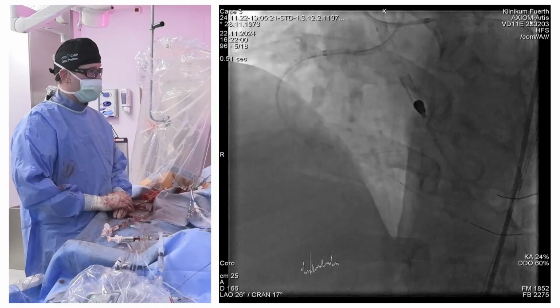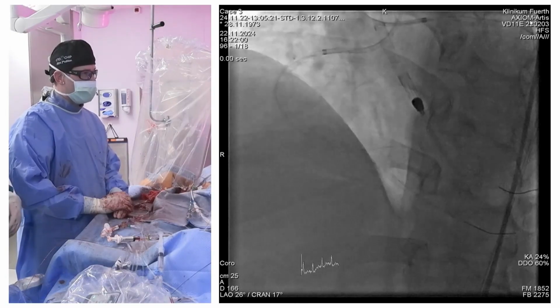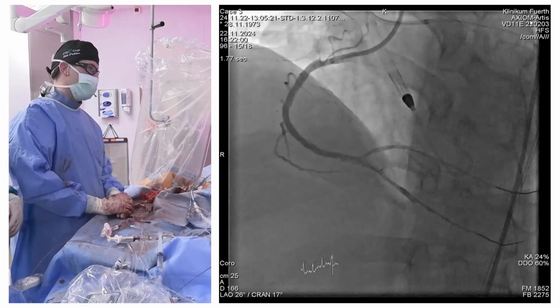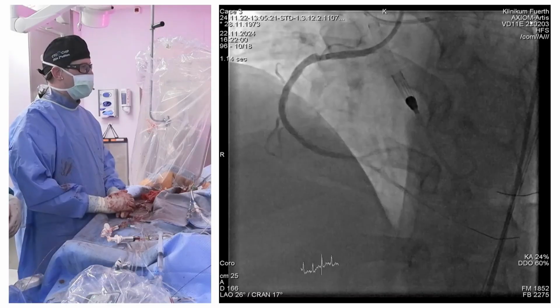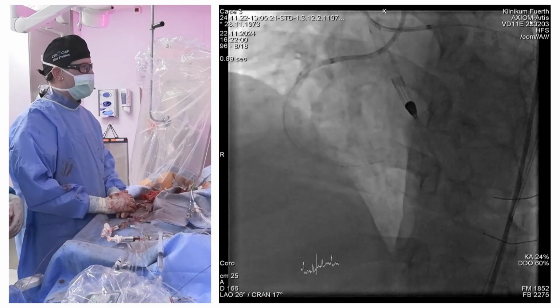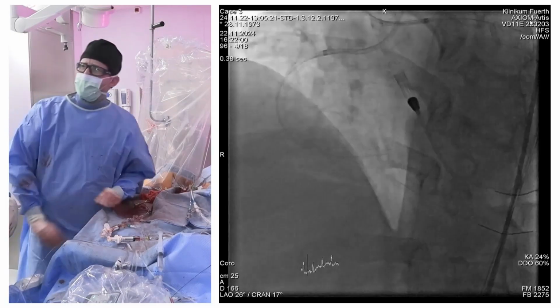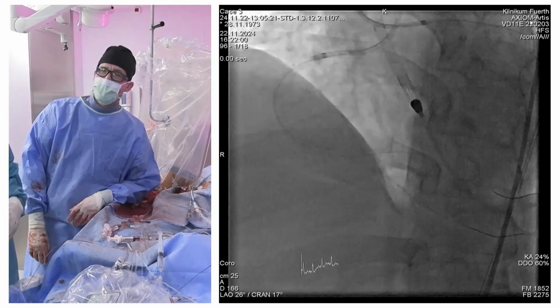So I think there's a short segment with no stent there, near the tiny side branches, and we might have to consider stenting this part. I'd do a DCB of all the PD and the branches and the bifurcation, and then look how it looks afterwards. A long DCB, as long as you have, 275.